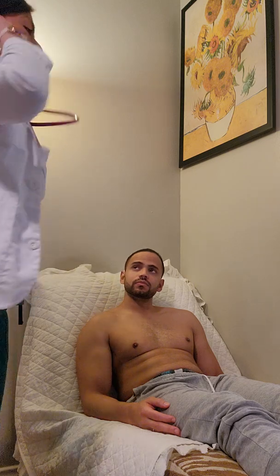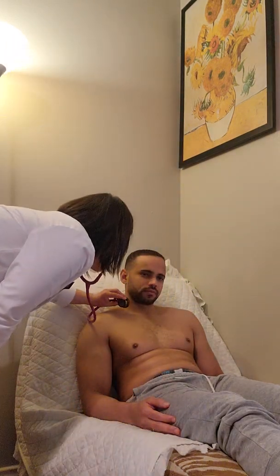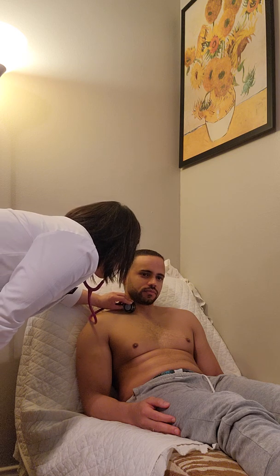Now, lastly, I'm going to move on to auscultating, and I'm going to start up and go down. So I'm going to use my diaphragm and my bell to check for any bruit on the carotid. Now, exhale and relax.